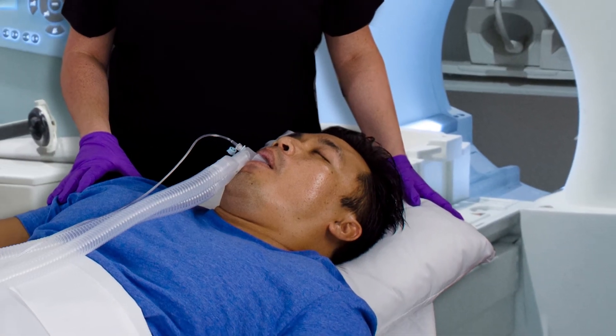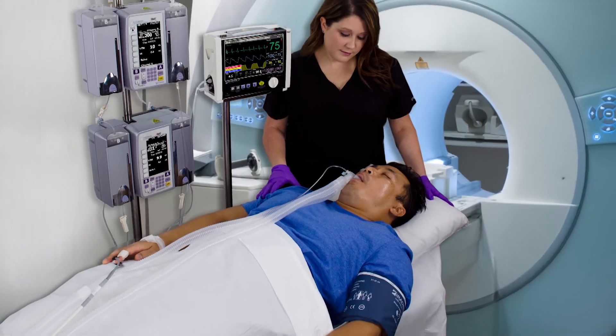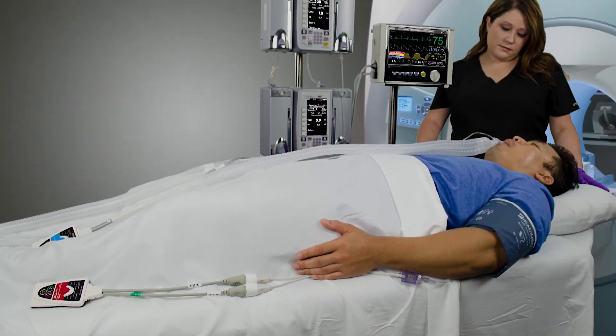As a best practice, it is recommended to keep the transducer out of the bore to avoid artifact. Additionally, it is also a best practice to keep the IBP pod and transducer at heart level to ensure accurate readings.